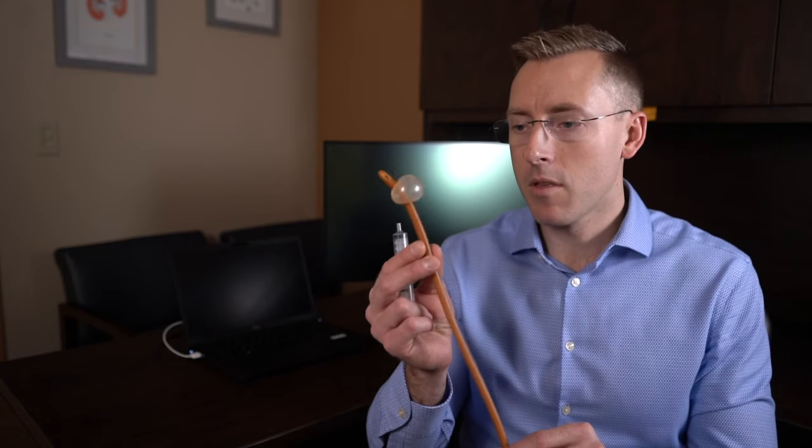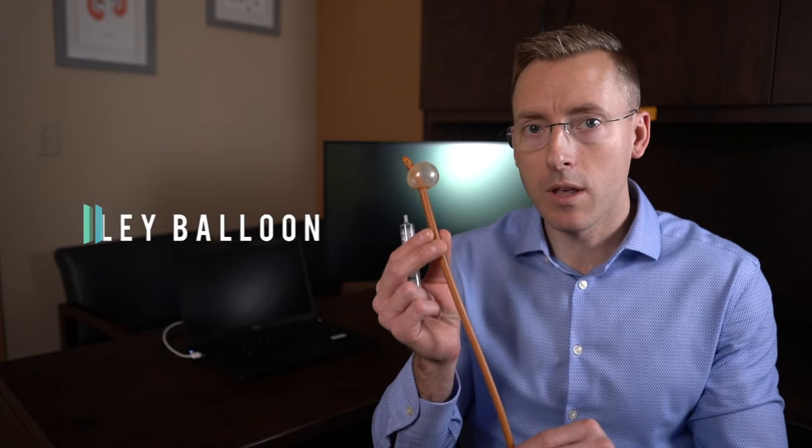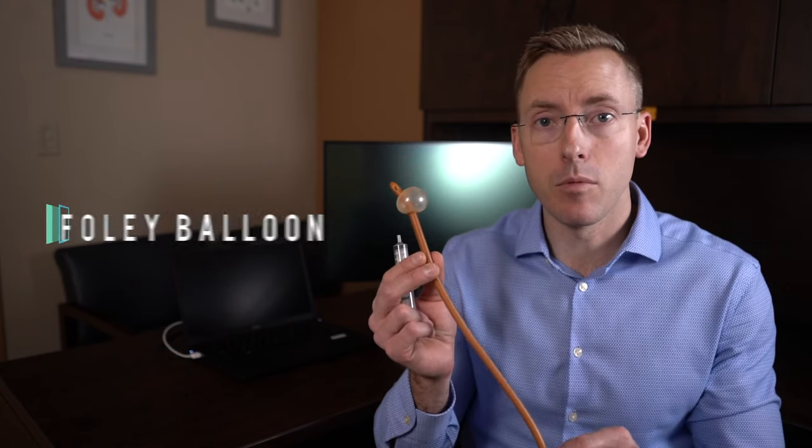The catheter has several different parts. Inside the body, this part, there's a balloon that holds the catheter in place and holds it in the bladder so the catheter does not get accidentally removed.